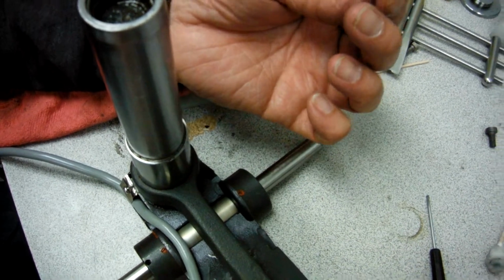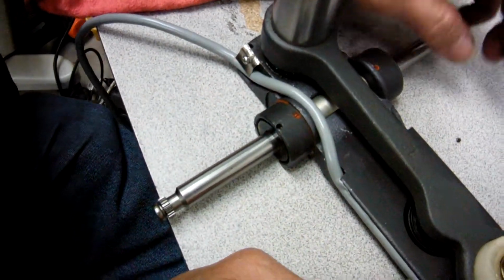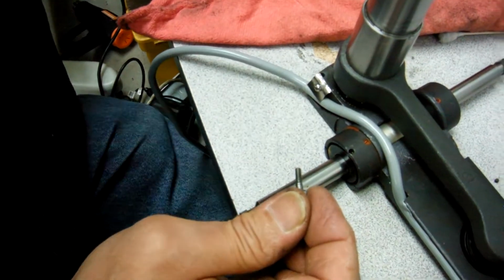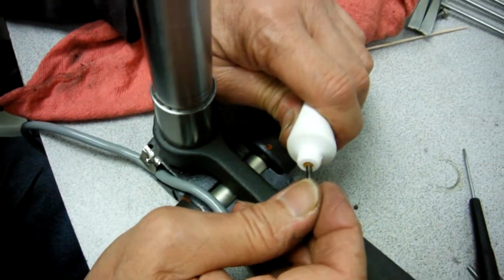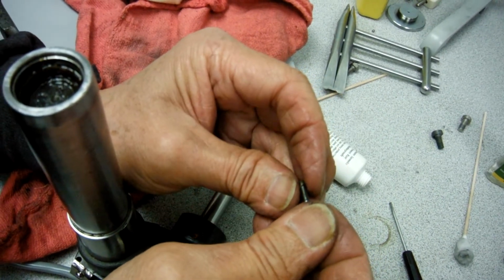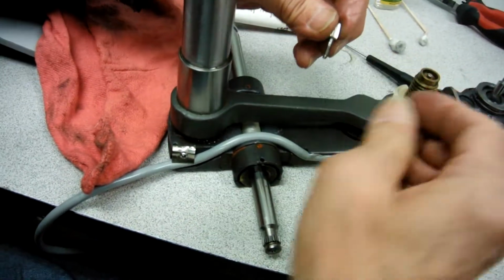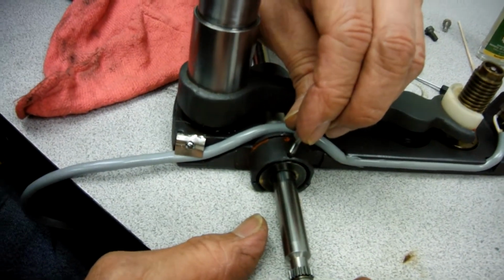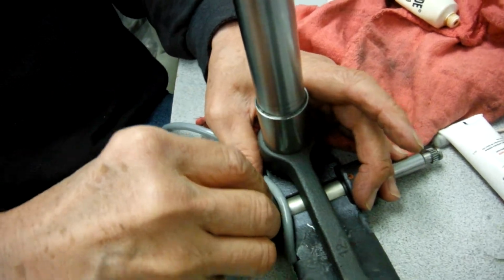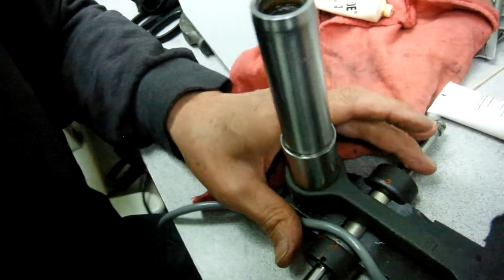So if you're missing this, you have to find one copper about this diameter and cut the piece like that, and then you put it in that hole. The easy way for me to put it in the hole is I'm going to get a little grease on the screw right there, and then I put the piece stuck to that, and then I just put it right into the hole. I'm just moving this hand so you can see where it goes to right there. Go to this hole, and then you can screw this one in. It's a little bit tricky to put it in.